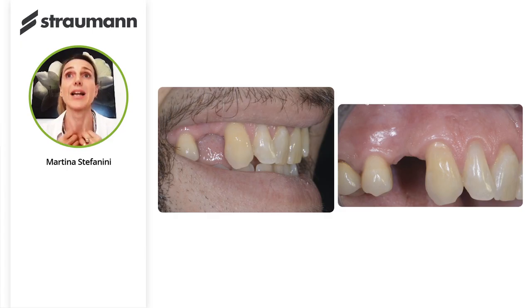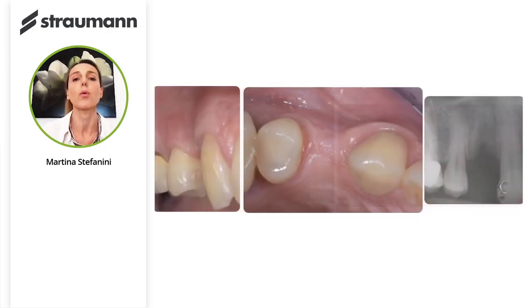Because when we place an implant in the aesthetic area from premolar to premolar, we have to give the right emergence profile and we have to give the right aesthetic result to our patient.